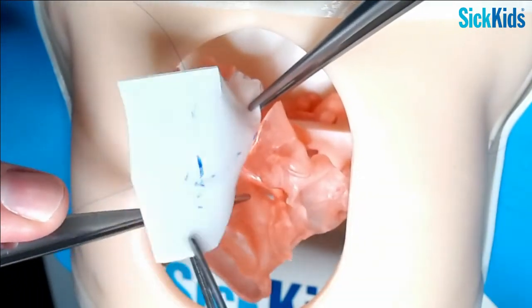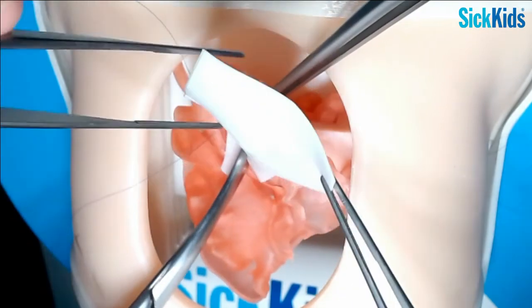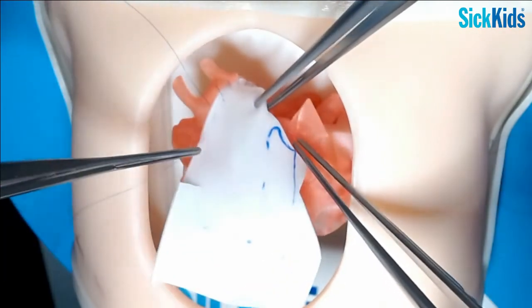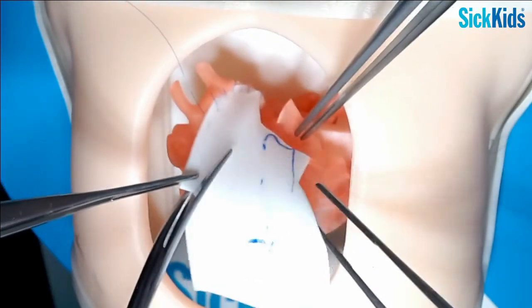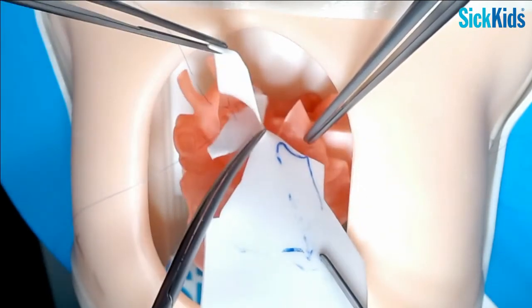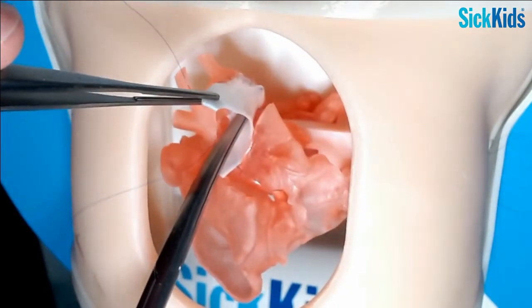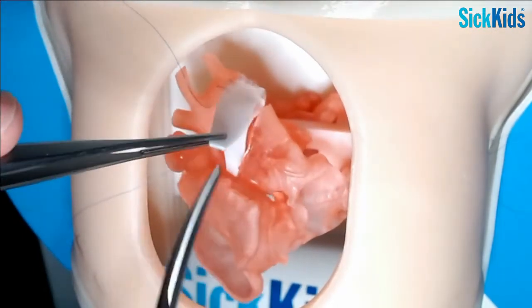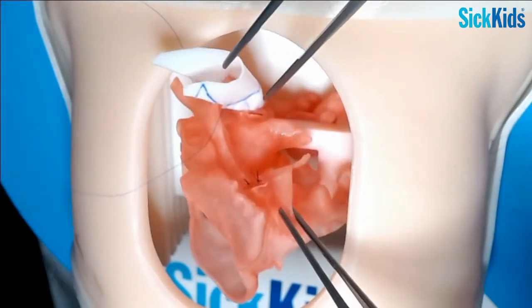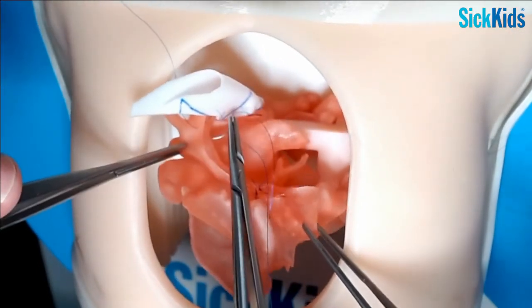So all you have to do is make your cut for length and then cut down to where you've marked the tip of the PA is going to go and connect your cut here to where that tip was. So that does not look anything like what you thought it was going to look like, right? But there's your artery construction. So we'll whip that around with big jumps, and I'll come around and help you guys make the cuts if you want.